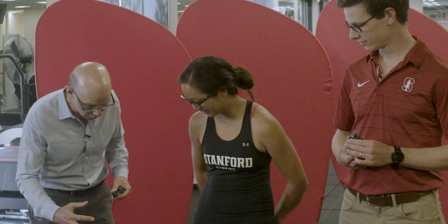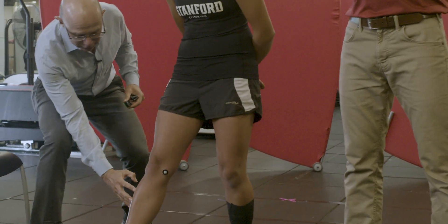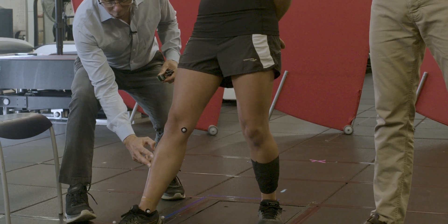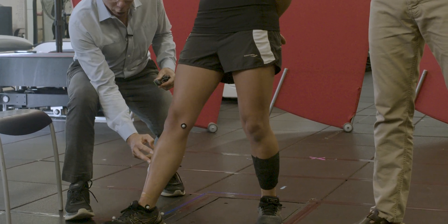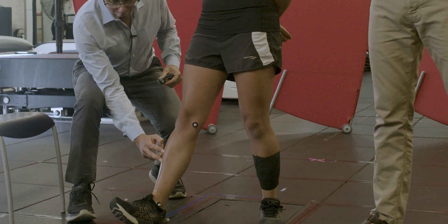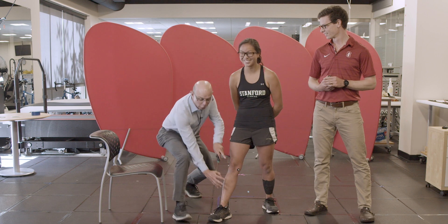When we place these electrodes on muscles, we palpate the muscle because you can feel when it contracts. In the very olden days we used to use that to record muscle activity. For example, to know when Hannah's tibialis anterior was on, we might put a hand on it and try to palpate when the muscle's on and off while she's walking. You can see how that would be not very accurate and somewhat disruptive.